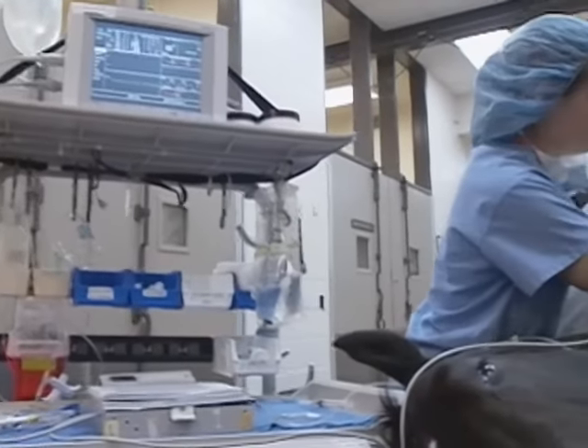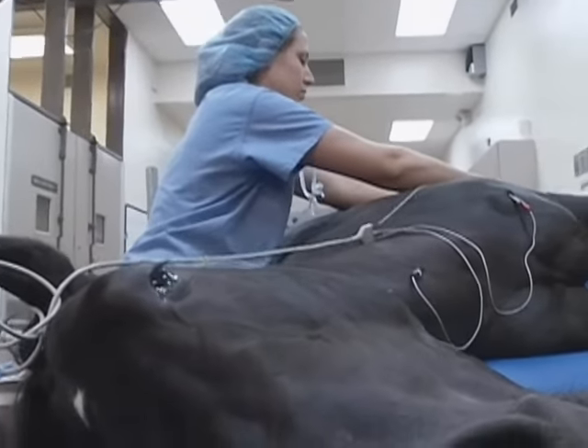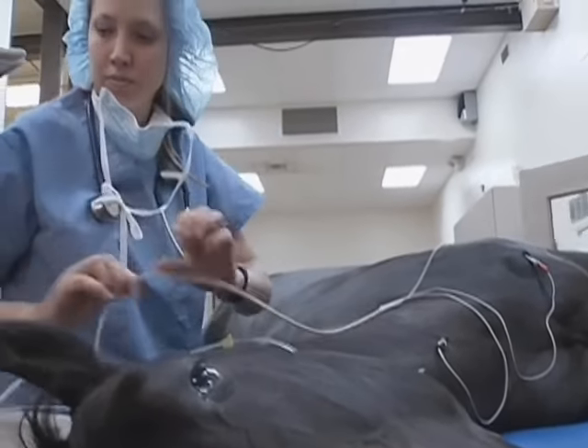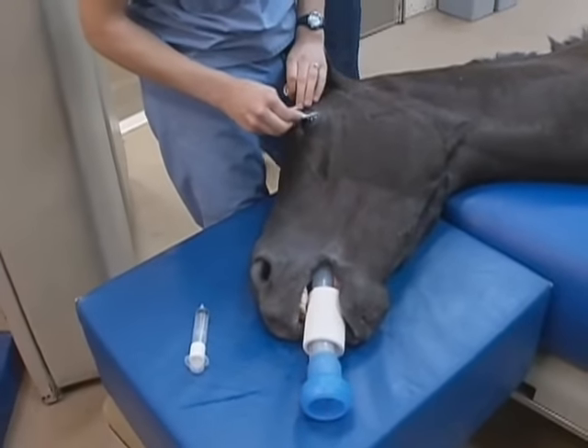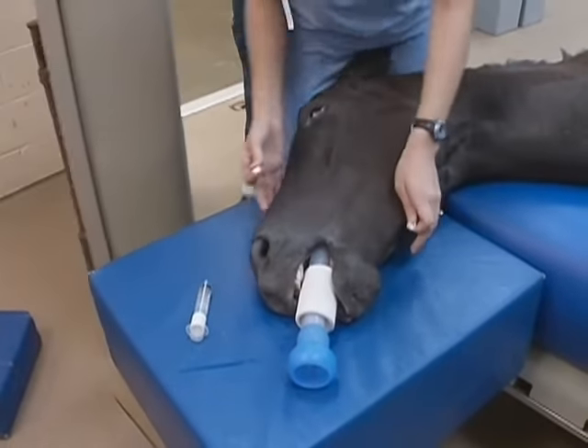Once the horse is properly positioned on the operating table, heart rhythm and blood pressure are the most important values to measure while the horse is under general anesthesia. Another aspect is that horses can't blink, and if they are blinking, maybe they need more anesthetic. So we place eye lube to prevent the eyes from drying out.